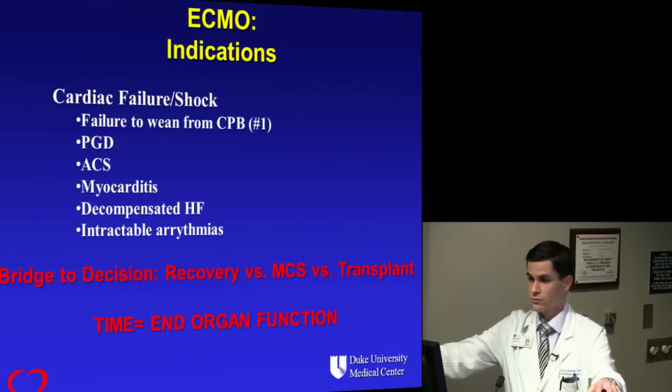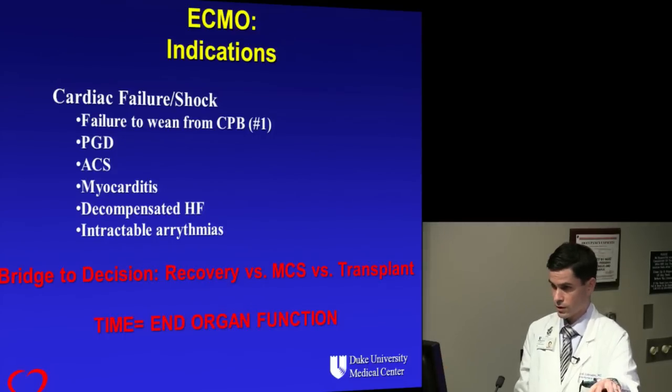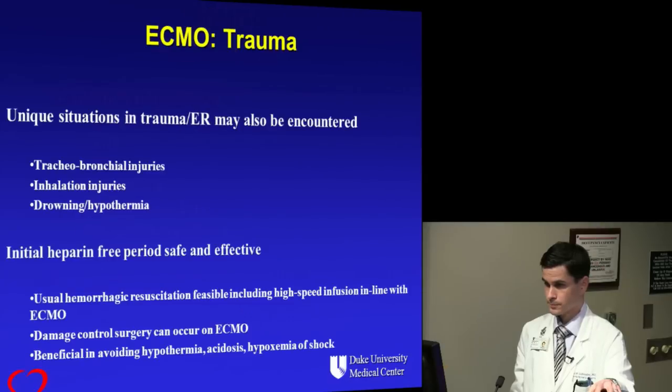We had multiple patients recover. If you walk through 3200 at any time, you'll see multiple patients on ECMO, or not multiple, but usually at least one patient who's on ECMO as hopefully a bridge to either mechanical circulatory support in the form of an LVAD or BiVAD support, or transplantation. And again, the key when we think about these patients is that time means their kidney function, their liver function, and their neurologic function. And so sooner is better.